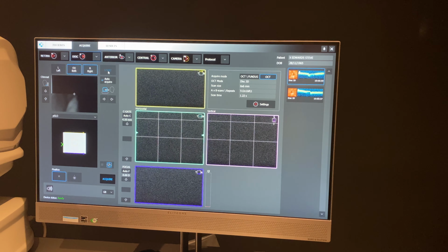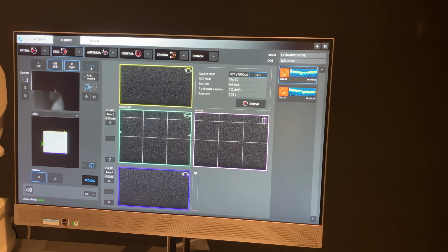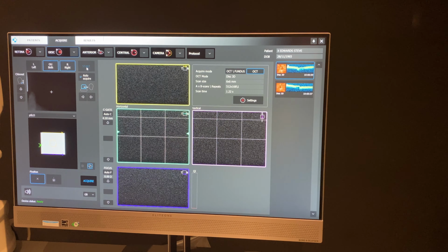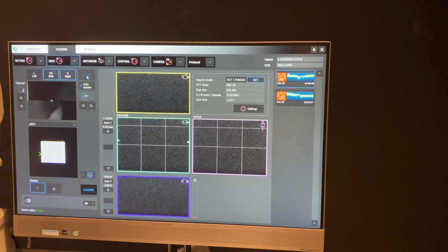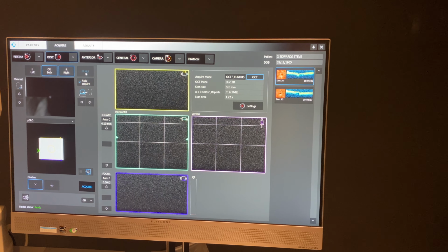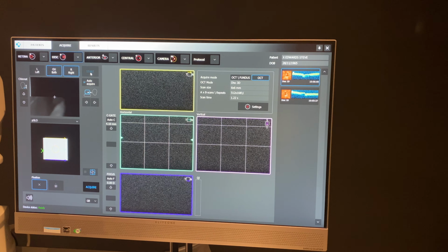Yeah, so the minimum pupil size for a fundus photograph is 3.3 millimeters. The minimum pupil size for an OCT scan is 2.2. And I've yet to come across a patient who can't do an OCT scan. I'm sure there's people out there. It will happen. But in terms of fundus photography, there are limitations for the pupil size. Fundus photography is a game between the light, the pupil size, how the patient can fixate, whereas OCT is very easy to do, and pupil size, well, I've yet to see it affect an OCT scan.